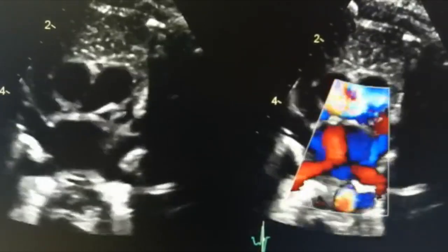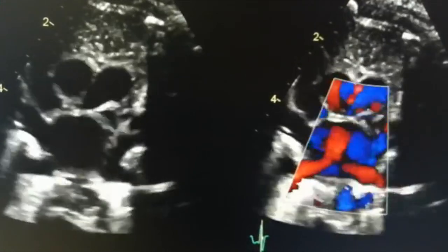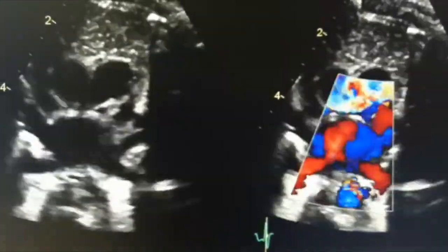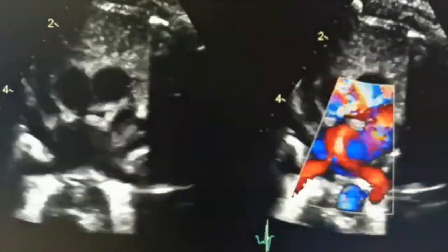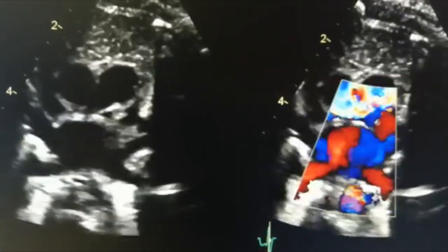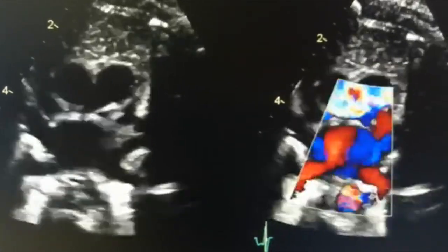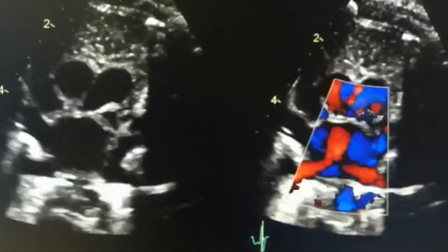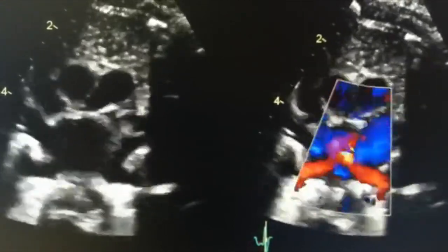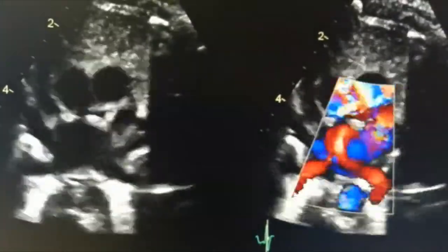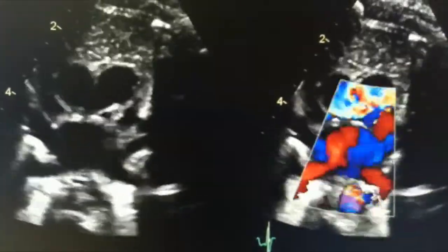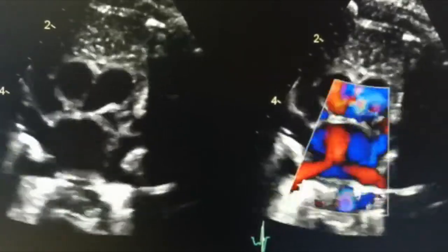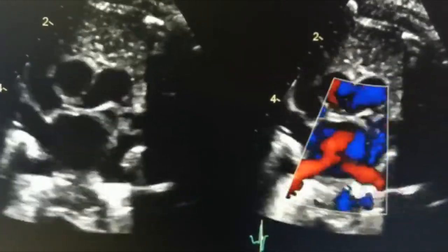Here is a lovely video of the CRAB view in 2D and with color Doppler. You can really see the four pulmonary veins, the aorta and the pulmonary artery. And also you can really see why this view is called the CRAB view.